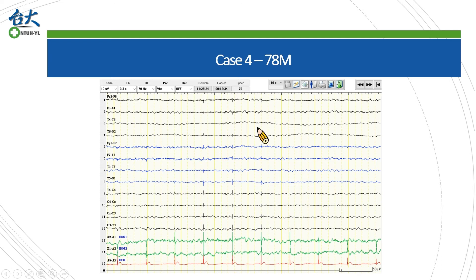Case 4 is much more intuitive. A generalized high-amplitude single spike co-occurs with synchronized EKG in the bottom red line. As taught by Professor Yu, we can see the most positive charge at the left temporal area where the negative discharge is located in the right temporal region. This is in accordance with the electrical field from EKG.